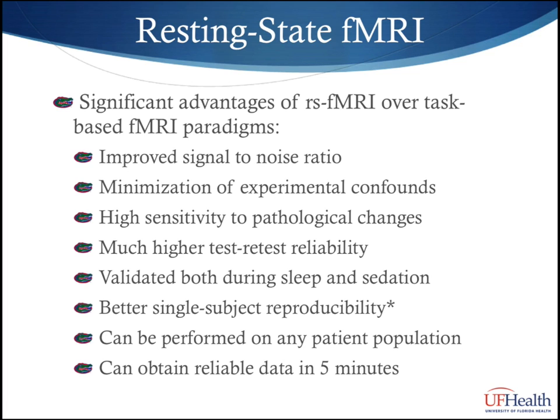What I mean by this is that many functional MRI studies present group-level analysis. This means multiple subjects are averaged and concatenated into a single model, giving the picture typically shown in fMRI publications. For people who have done these studies, it's well known that the individual subjects rarely, if ever, look identical to the group-level data. This has been a tremendous barrier in the clinical applicability of functional MRI because of its poor single-subject predictability.